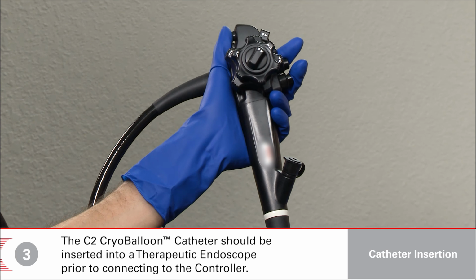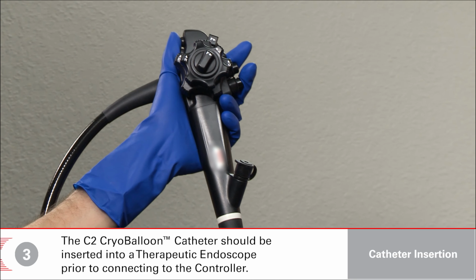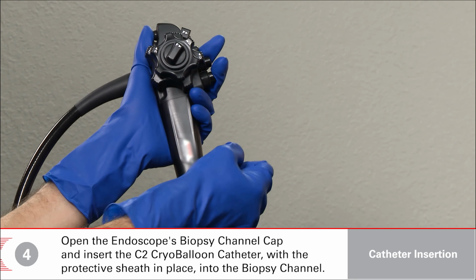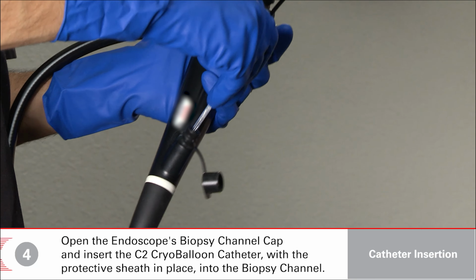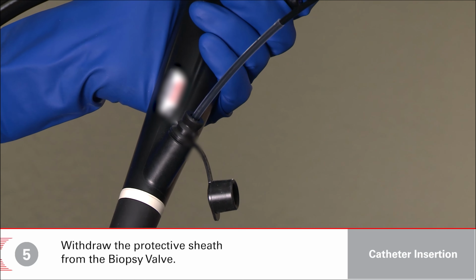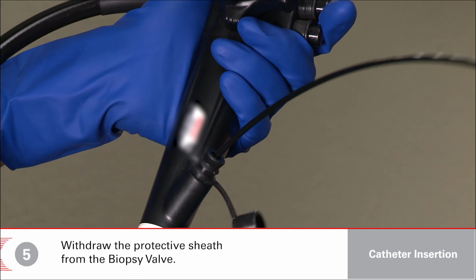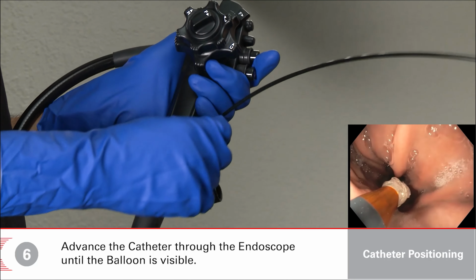The C2 CryoBalloon catheter should be inserted into a therapeutic endoscope prior to connecting to the controller. Open the endoscope's biopsy channel cap and insert the C2 CryoBalloon catheter with the protective sheath in place into the biopsy channel. Withdraw the protective sheath from the biopsy valve. Advance the catheter through the endoscope until the balloon is visible.